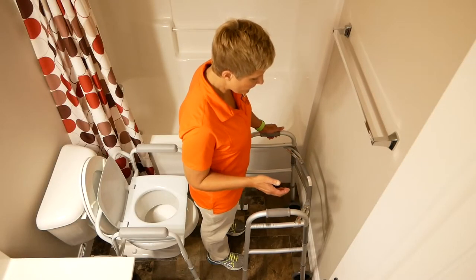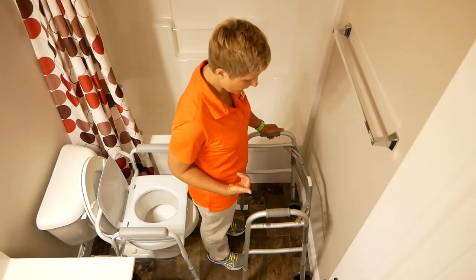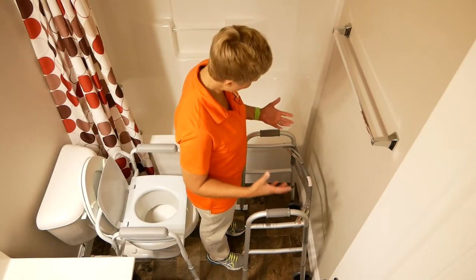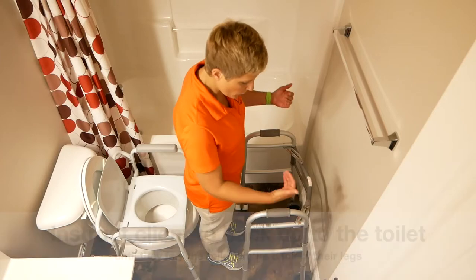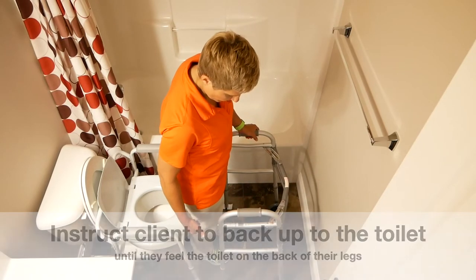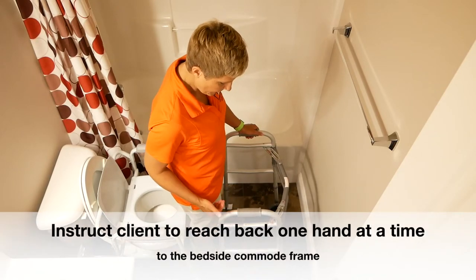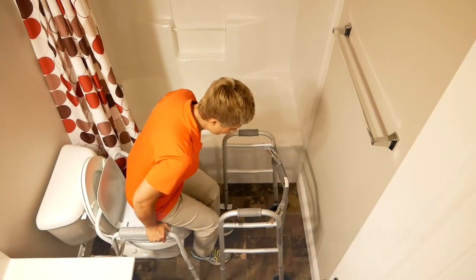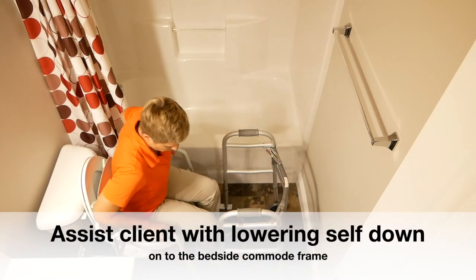As a caregiver giving someone verbal cues on how to use a bedside commode frame over the toilet: if they come into the bathroom, whether they're on a walker or not, they're going to back up to the toilet until they feel it at the back of their legs. You're going to ask them to reach back one hand at a time to the bedside commode frame and assist in lowering themselves down onto it.